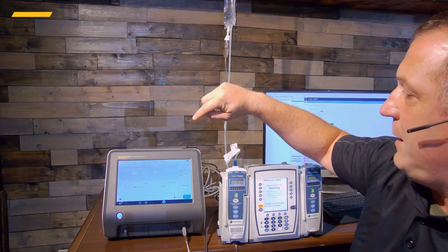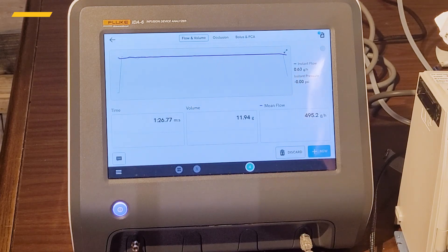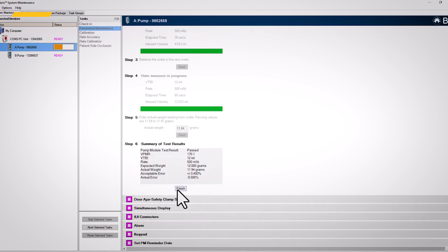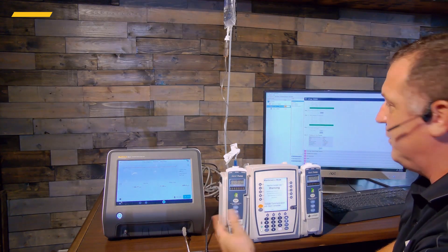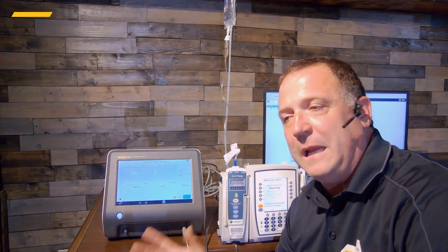Back on the normal screen, my total volume was 11.94 grams. I'll enter 11.94 into the software and hit Next — that is a passing score. The rest of the tests we won't show in this video because they're done directly on the pump: checking door safety clamps, simultaneous displays, IUI connectors, alarms, keypads — those just use the Alaris software and don't need any additional test equipment. Thank you very much for joining us and watching this video — I look forward to seeing you in the next one.